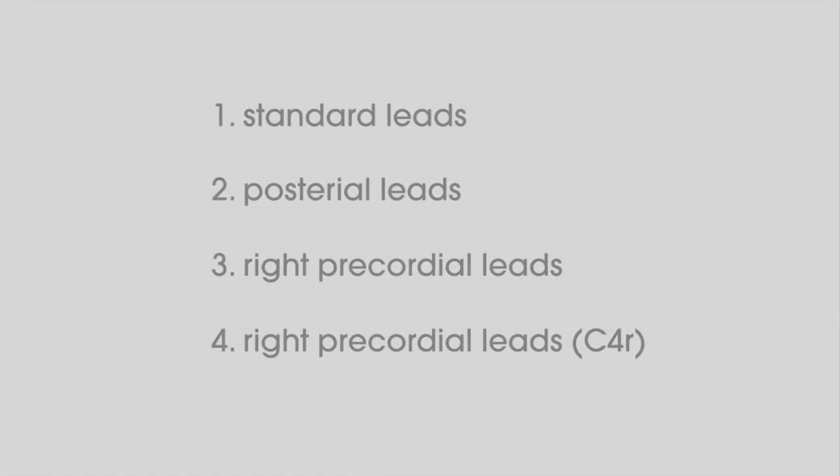We will show you the four most common electrode placements. These are standard, posterior leads, right precordial leads, and right precordial lead C4R.